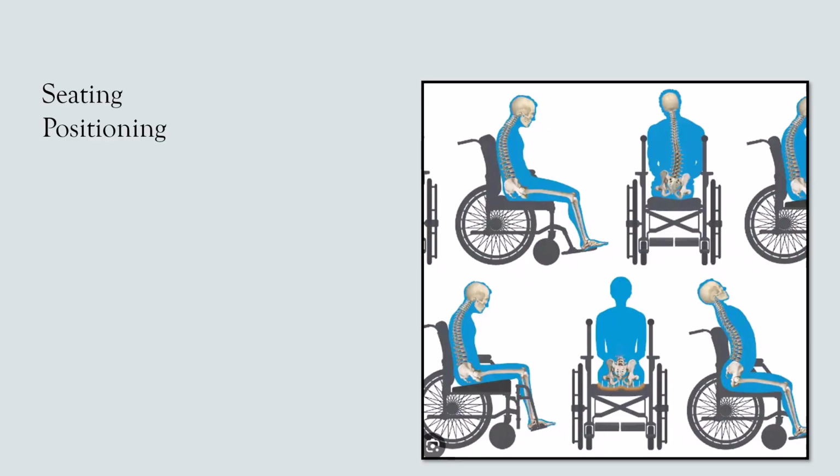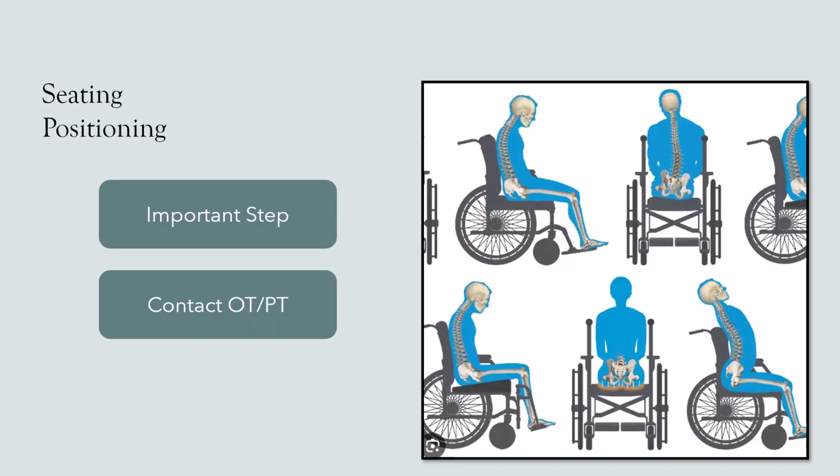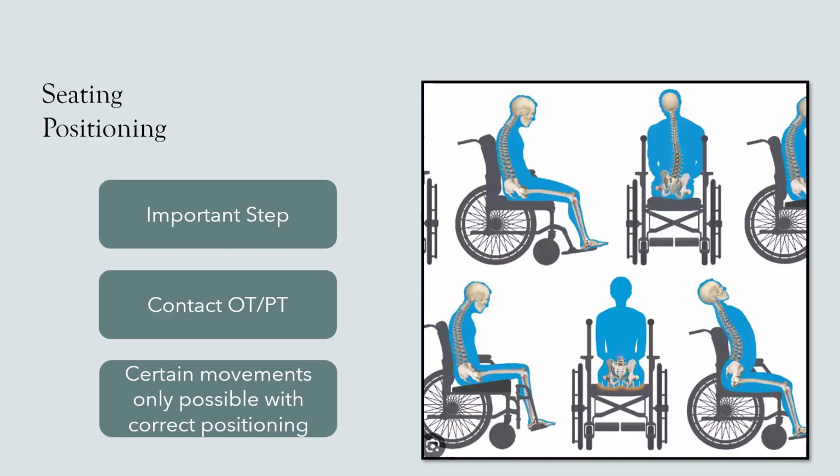Let's talk about seating and positioning for a minute. This can be your first step. Contact your OT/PT for support. You may even find that certain movements are only possible with correct positioning.